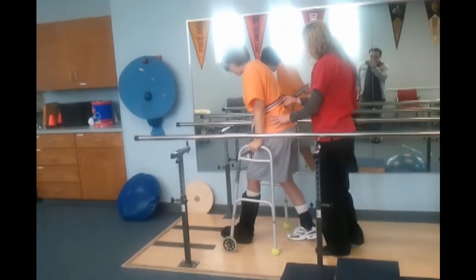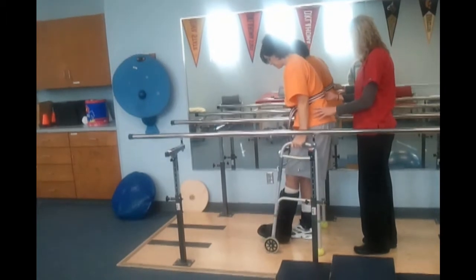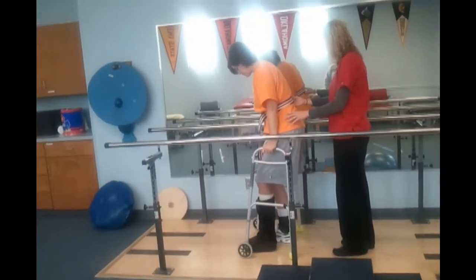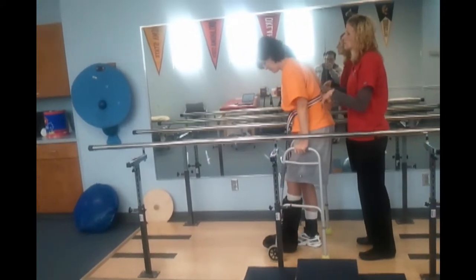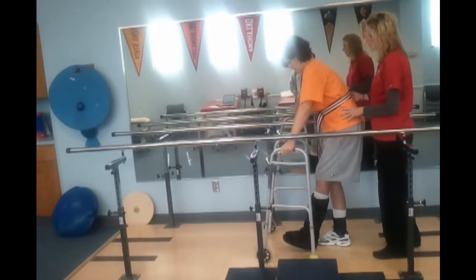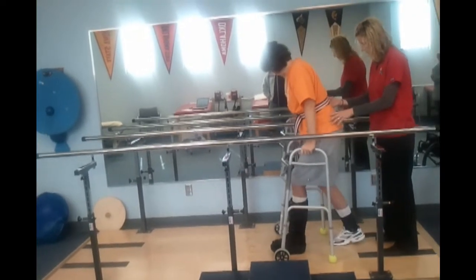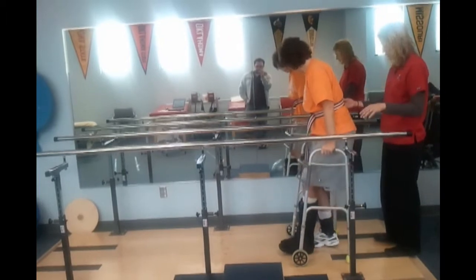I feel I need to go more to the center. Go wherever you need to. I can see easily. The good thing about backward walking is that you're going to have to do very minimal of it — like spin around and back up to the toilet, or spin around and back up to something that you're going to sit on. That's the only time you're going to have to be going backward. So really, if you're backing up at home, there should be a chair or a toilet behind you.